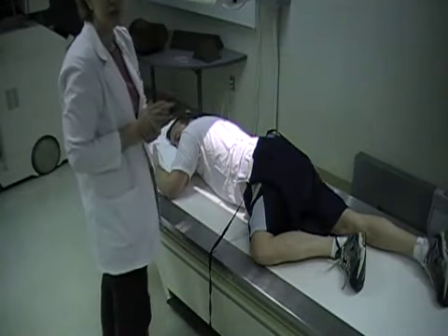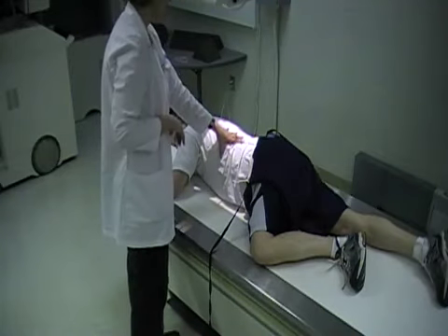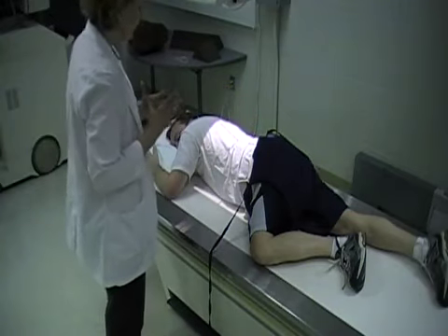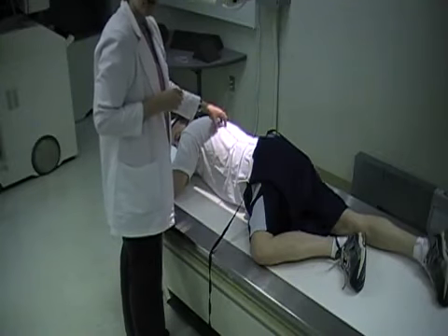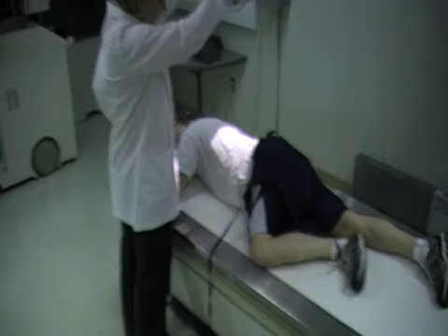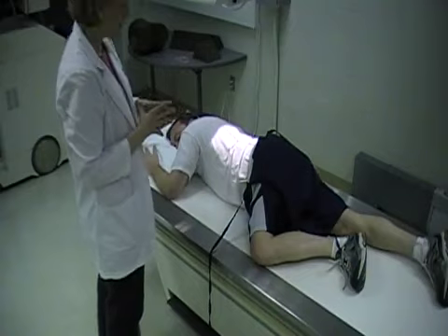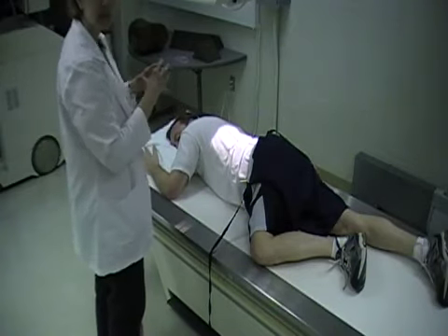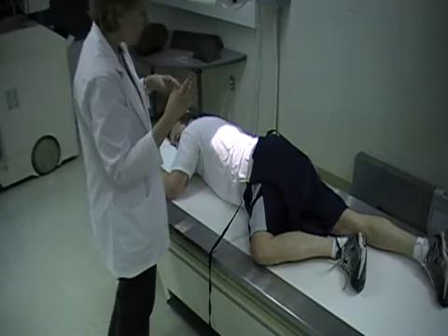So this will be your RAO. Just remember, this is the left side of the body. This will be the right side of the body that's down, so be sure that you do mark the correct side of the body. If you are using a smaller image receptor, the 11 by 14, it will look more along that size light field. Have your film in lengthwise, because this will get the length of the stomach better, because when they're in this position it tends to elongate.